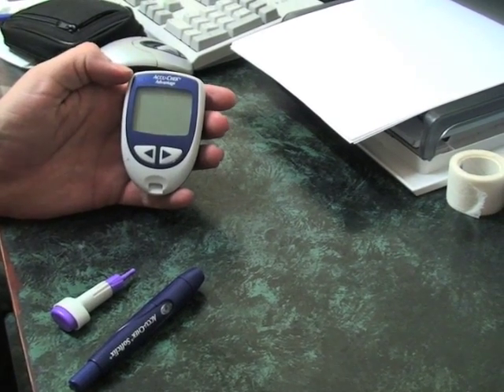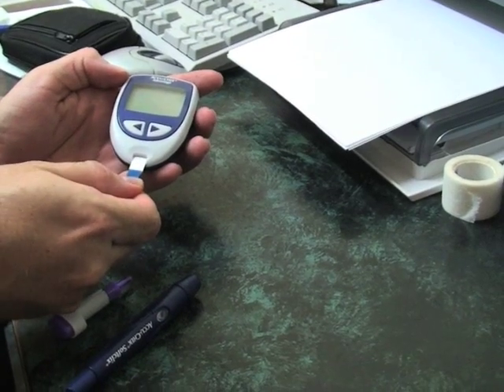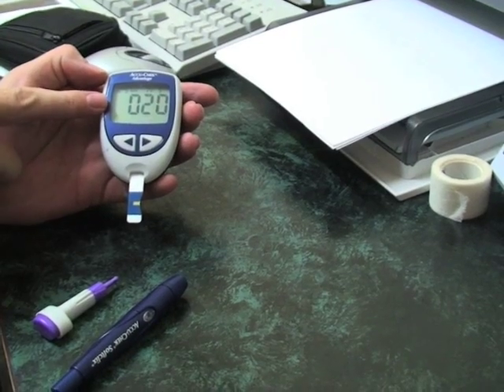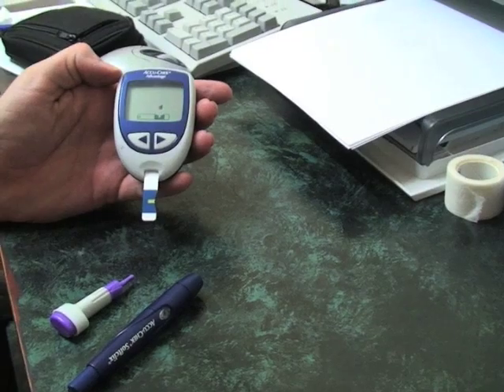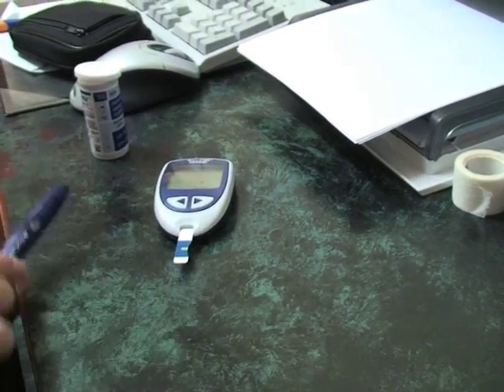The first thing you need to do is take the test strip and place it inside the machine. It goes face up in there. First thing you'll see is a number — that's just a check number — and then it'll tell you to put a drop of blood onto there. Put this down flat on the table for the moment.